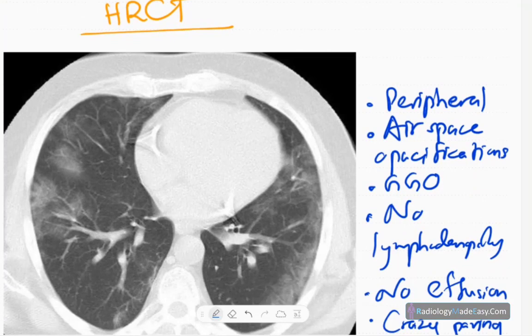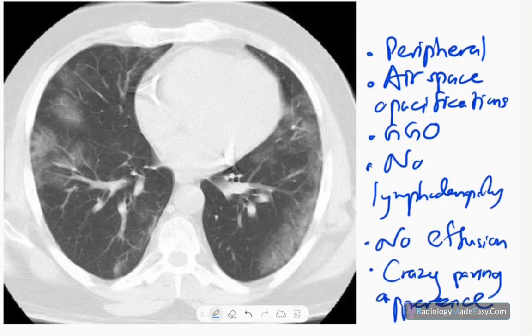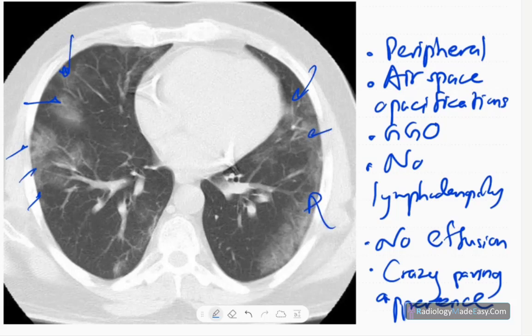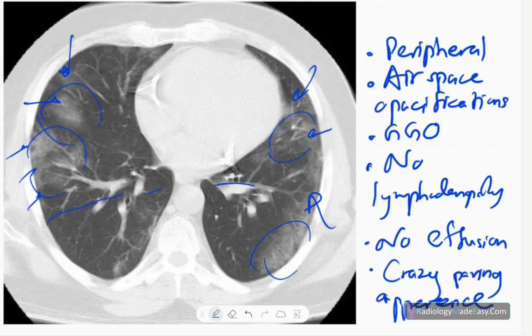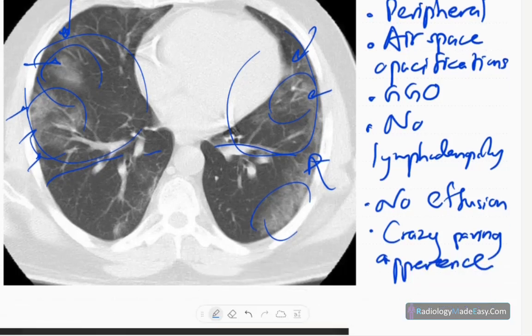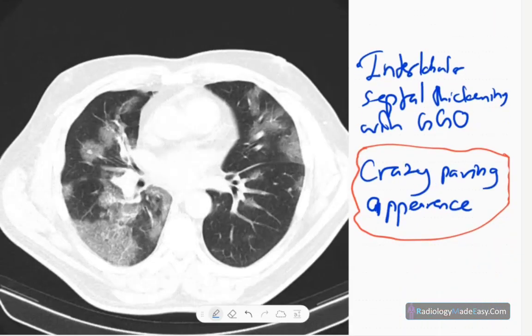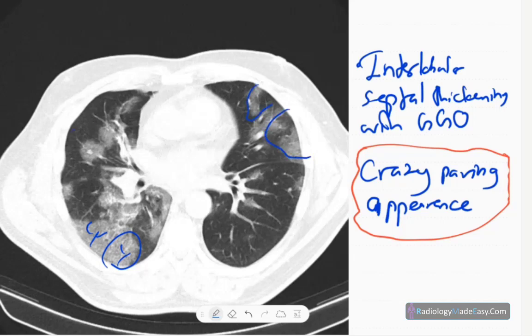On HRCT, the high-resolution CT of the chest, you can see airspace opacification of the ground glass type peripherally — specifically in the superior segments of both lower lobes, the middle lobe, and the lingula. There are no effusions or lymphadenopathy. As it progresses, interlobular septal thickening develops, creating a crazy paving appearance — ground glass opacification combined with interlobular septal thickening — seen peripherally.